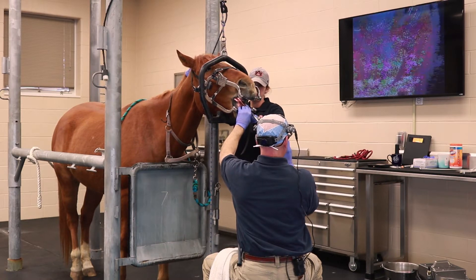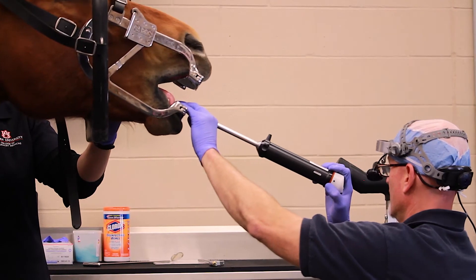It's just a fantastic instrument to allow for a thorough oral examination in the horses, looking for abnormalities, very subtle abnormalities — being very specific and precise and being able to pick up those subtle pathologies.